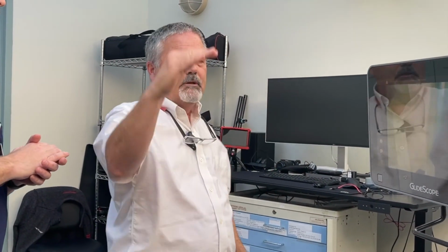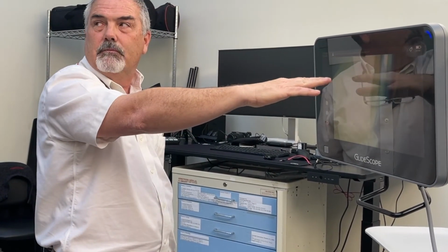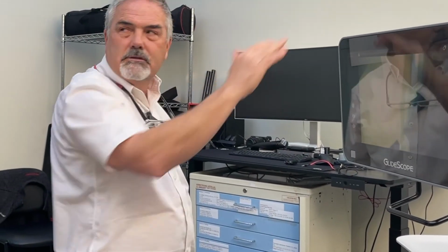Right. And remember, anatomy is on a two-dimensional plane this way, but we need to be able to see in our mind what's in front of the video laryngoscope, what's past the vocal cords, and that's that curve that is a serpentine curve. And so that's the challenge now, is how do you get people to think in a different axis.